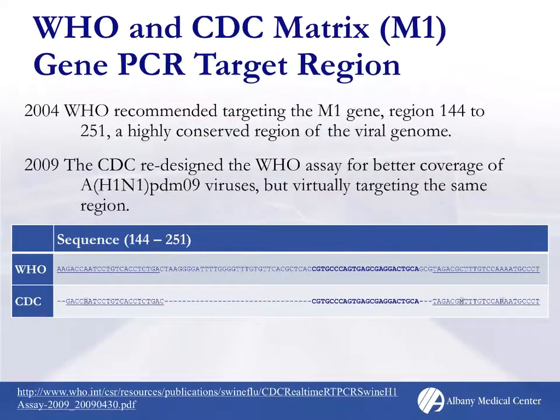So what about molecular tests? In 2004, the WHO recommended targeting the M1 gene, in particular the region of nucleotide 144 to 251, because it's considered to be a highly conserved region.